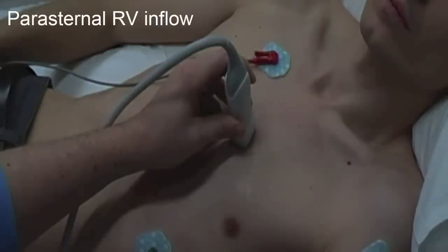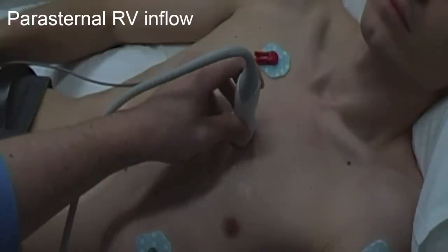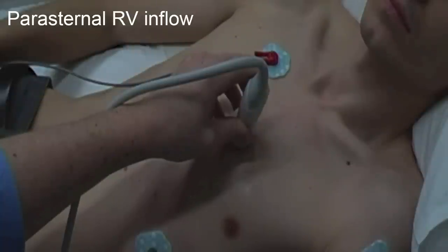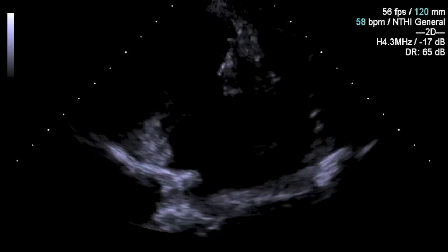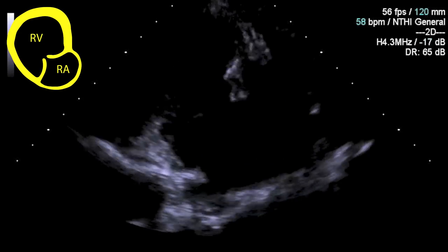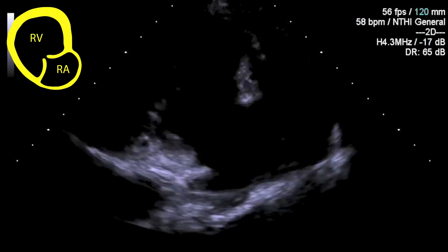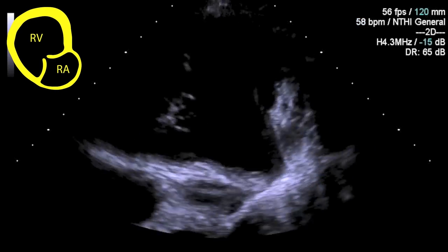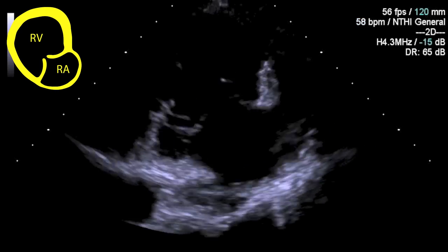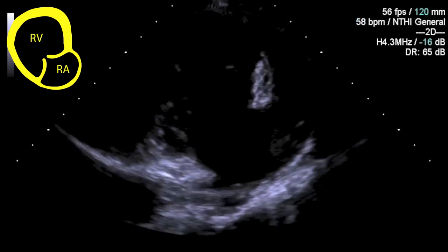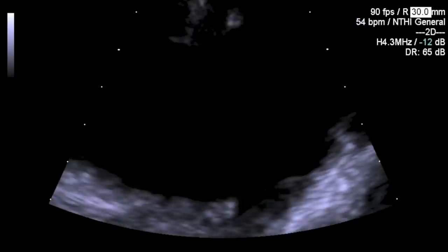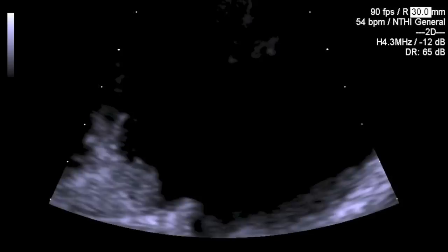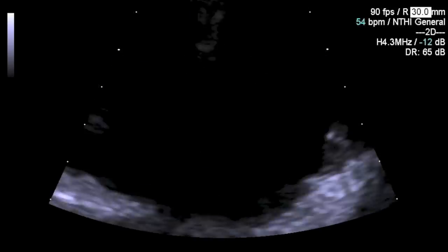The parasternal RV inflow view is achieved by tilting the probe down, directing towards the patient's right hip from the parasternal long axis. Here you can make an assessment of the right atrium, right ventricle, and tricuspid valve. Observe the leaflet movement and apply colour flow Doppler to assess for gross valvular regurgitation.